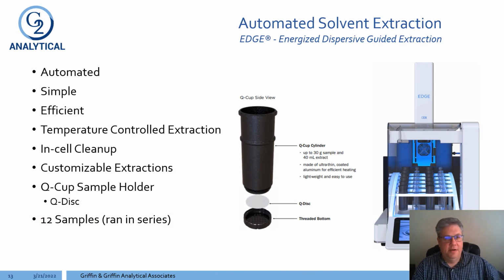So obviously, as I've followed the Edge and its introduction into the market, one of the areas that has always been interesting to me is its use as a replacement for QuEChERS, specifically for pesticide analysis. Well, I got to thinking that it might actually work well for our modified QuEChERS and also even for our solid liquid extraction. So my thinking is, could we develop a single method, or maybe a couple of different methods depending on the complexity of the extraction, to allow us to automate the sample preparation for these samples that we have.